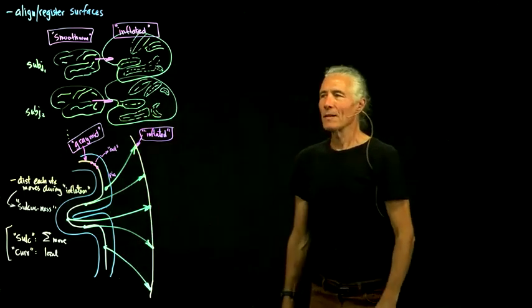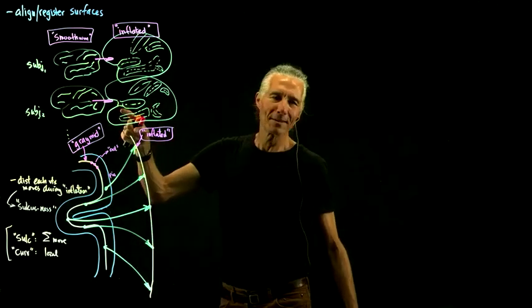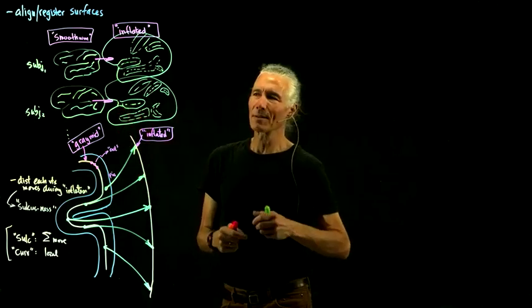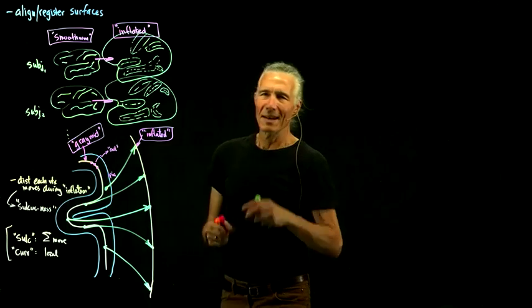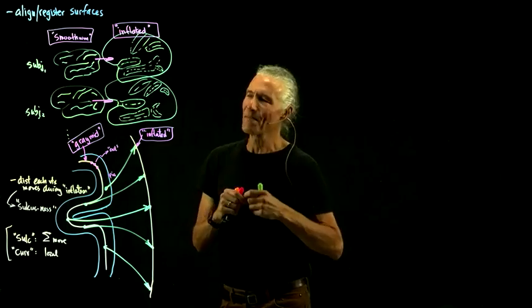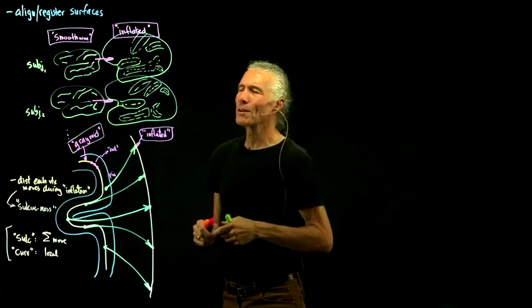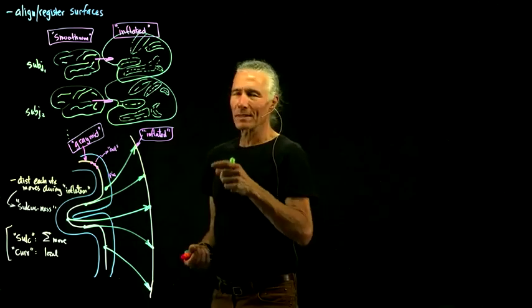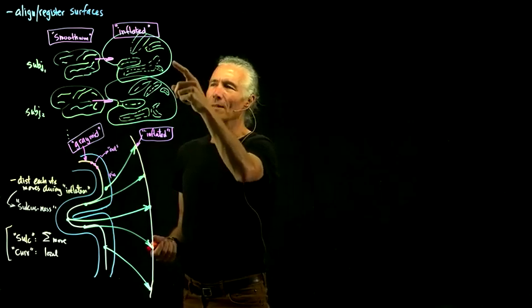So I first started forcing the brains to be an ellipsoid, and then tried to align the ellipsoids. But that's kind of nasty, dealing with the way that the surface moves on ellipsoids. So Bruce Fischl rewrote this in the distributed FreeSurfer to do it on a sphere.